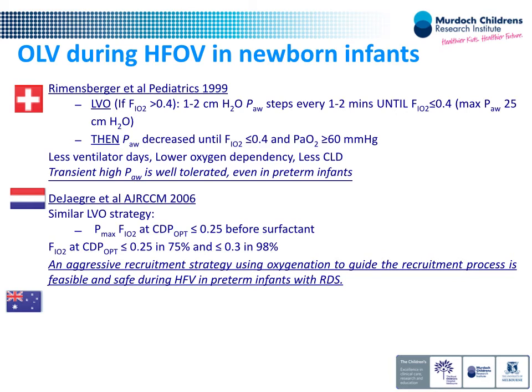And if I do an X-ray and do a tube check before giving a surfactant, this means that I would not leave the baby on a low setting of this oscillating a collapsed lung, which needs a lot of oxygen to be put in this baby. So I want to be lung protected. I want to do both. Be lung protected during ventilation and give surfactant. These are not mutually exclusive events.